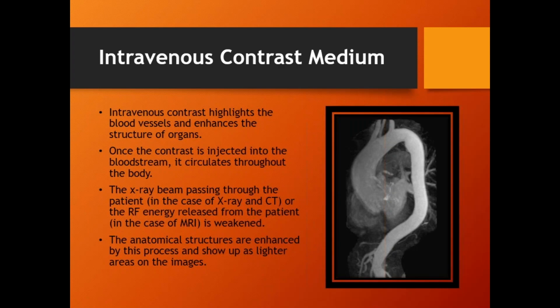Okay. So basically, one thing I just want to point out: the contrast fluid, which is in this syringe right here, blocks X-rays. Long story short. So that's how these images work. When we fill the blood vessels up with this contrast fluid, the X-rays don't penetrate the patient, leaving those areas on the image brighter. Okay. So that's the gist of how these work.